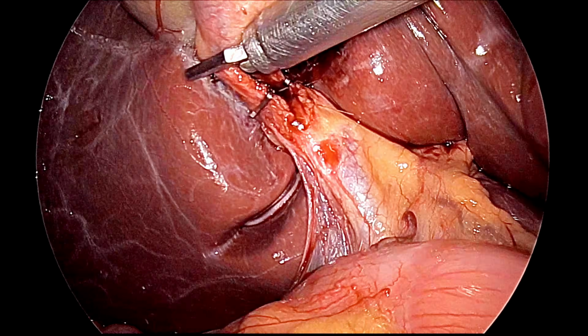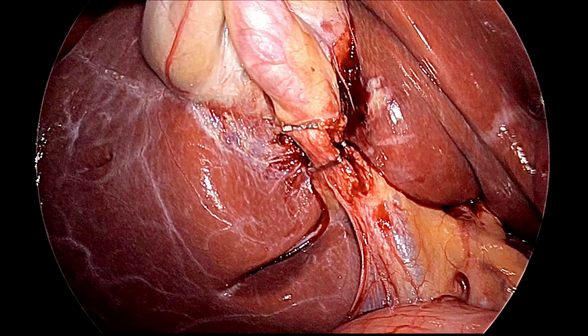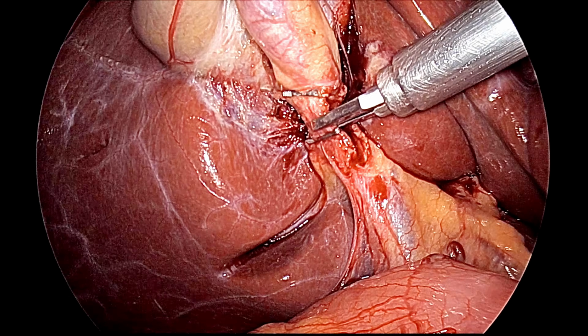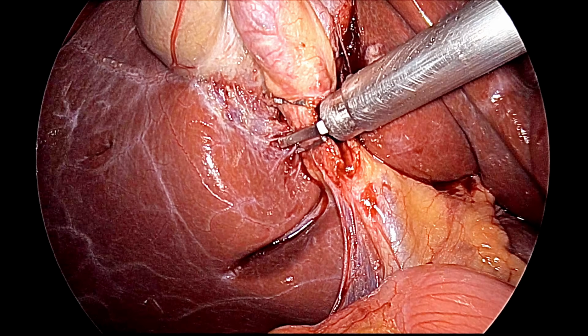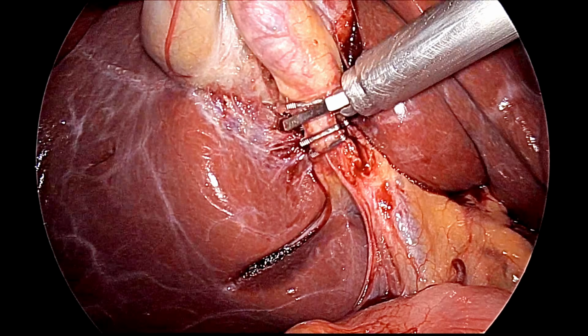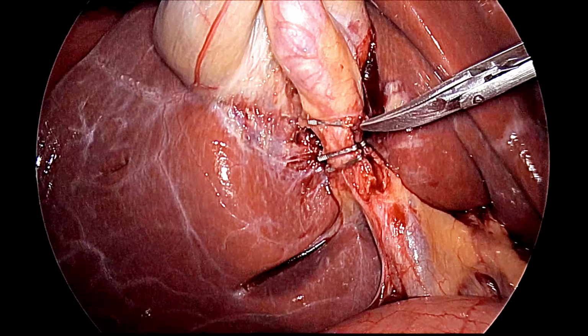So, this is the first clip, and then we will apply the third clip 9 millimeter away. So, this is the third clip, and then we will sweep the back of the cystic duct by the jaw of the clip applicator, and then this is applying the second clip. That should be 3 millimeter away from the first clip. After that, here we are using the scissors to cut the cystic duct.